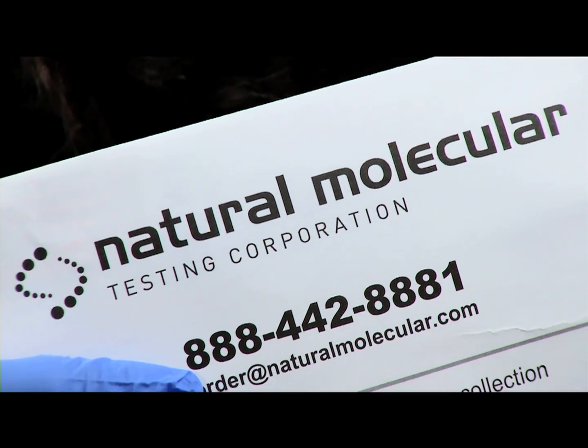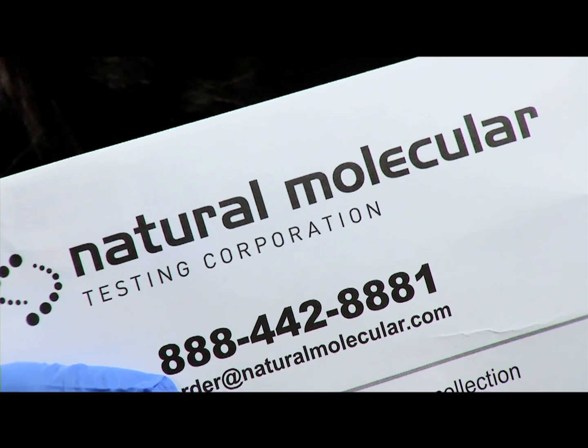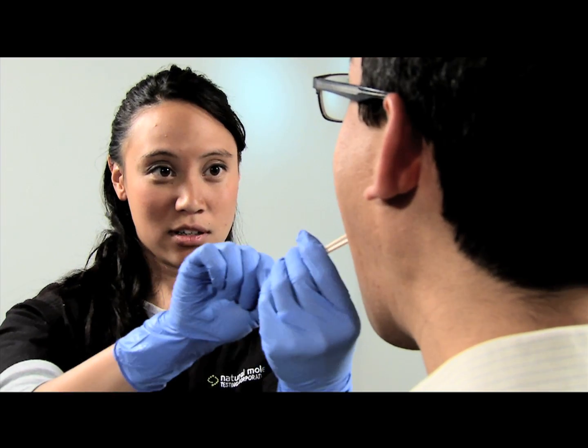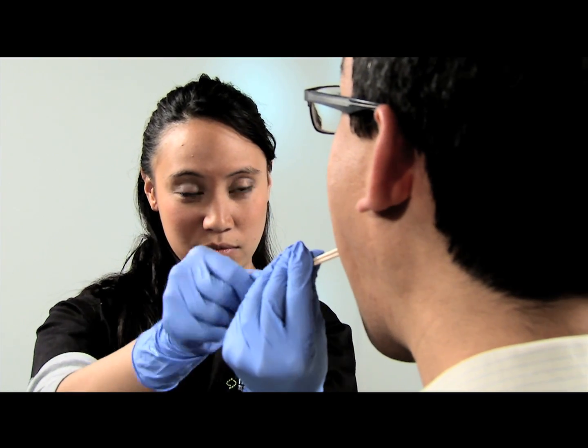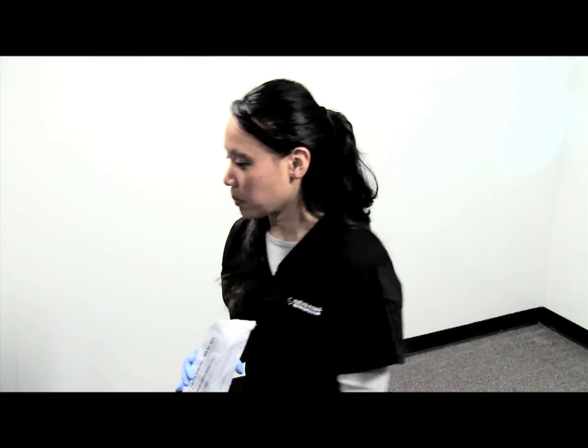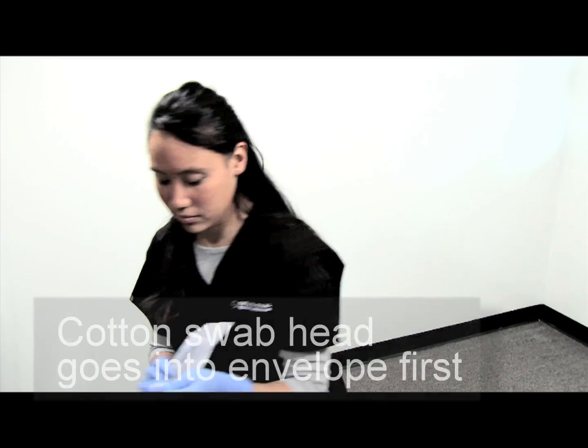It's important to follow this procedure for rapid lab processing and to avoid compromised results. Repeat this process on the other cheek with two fresh swabs. Let them dry and place them in the envelope — remember, the cotton head goes in first.